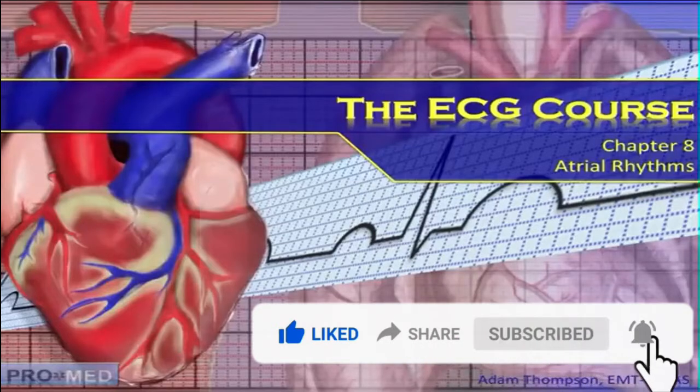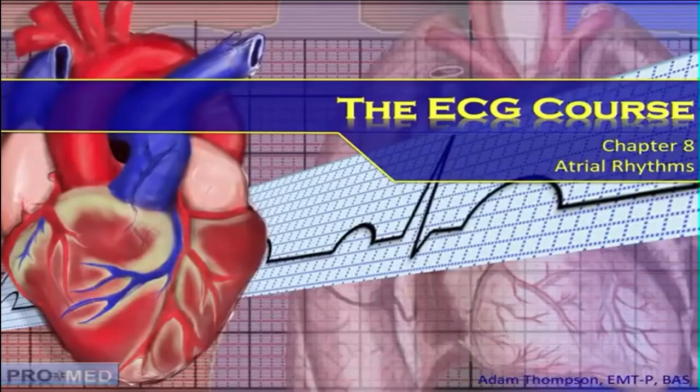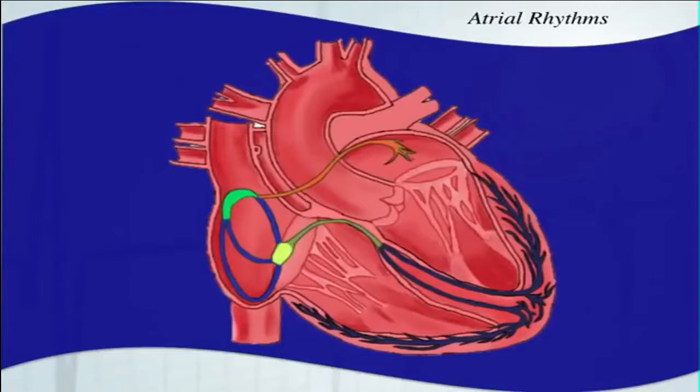This is chapter 8. In this chapter, we're going to talk about atrial rhythms. In the first chapter, we talked about sinus rhythms, which we said originate from the SA node. In this chapter, we're talking about atrial rhythms, which originate from anywhere in the right or left atrium, except for those rhythms that originate in the SA node. Okay, so let's take a look.